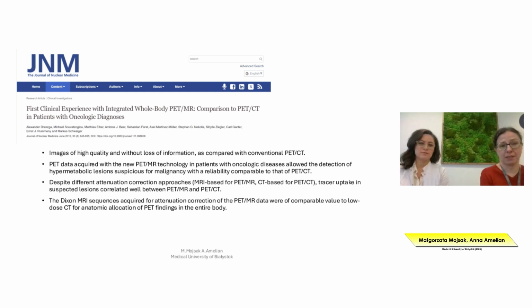Well, there were some disadvantages of PET-MR that Professor Kulicki mentioned.